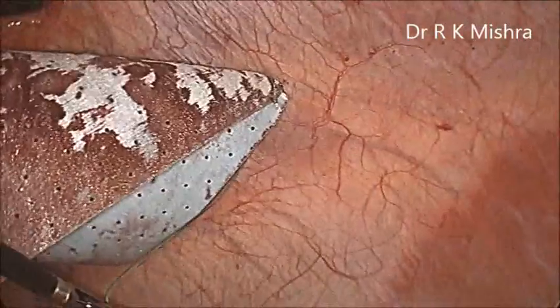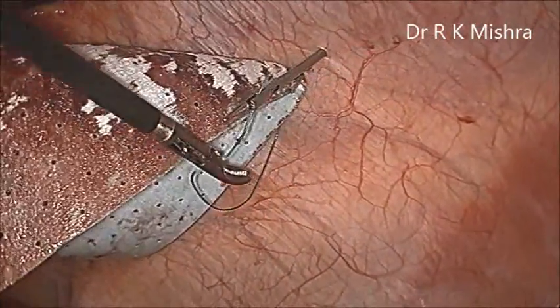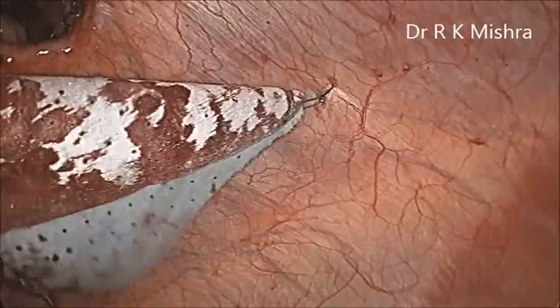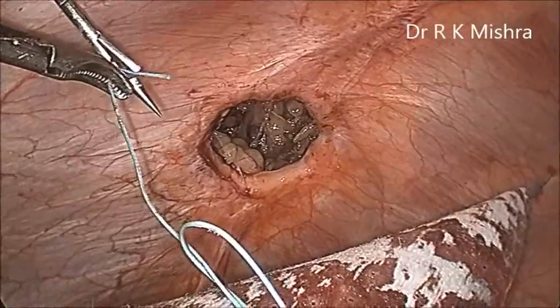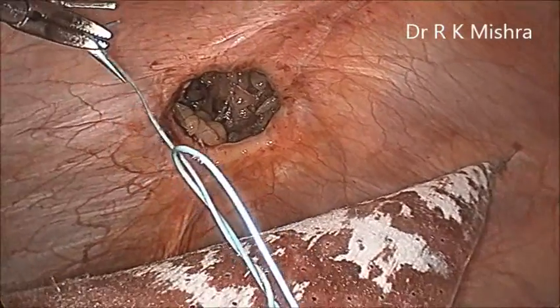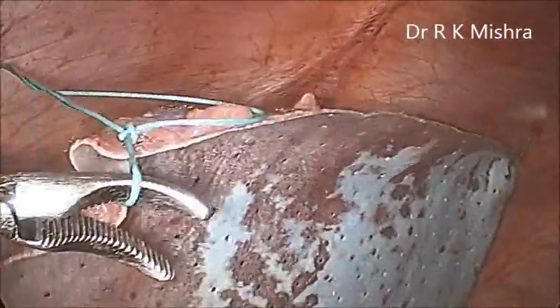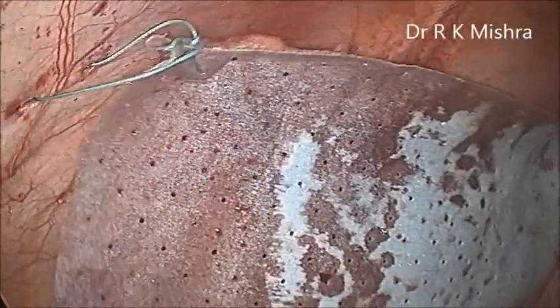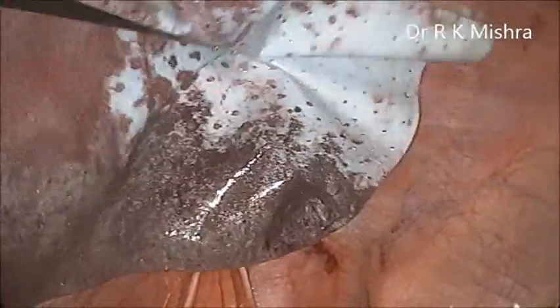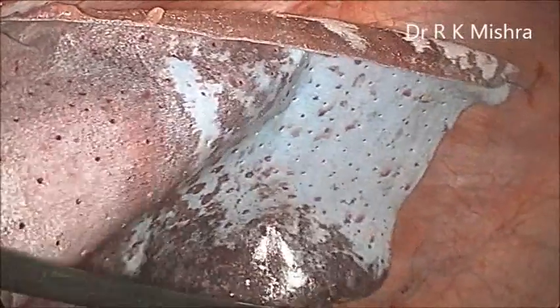Again this is the second end of the suture, and one by one it will be pulled out, and then you will tie the knot. This is the fourth corner — you will hold it and one by one it will be taken out. It is important that the center of the mesh should be at the center of the defect. Then you can use the tackers. Sometimes we use fibrin glue also, but in dual mesh, fibrin glue is not very suitable — for Vipro mesh, fibrin glue is better. So here we are using dual mesh, which itself has one absorbable layer, so chances of adhesion are not there.